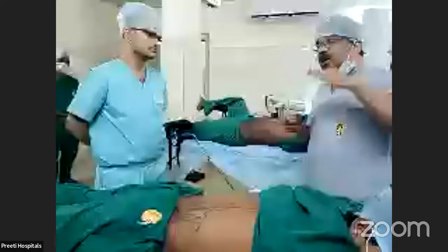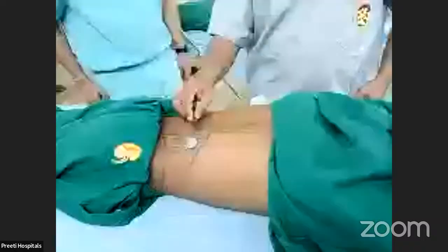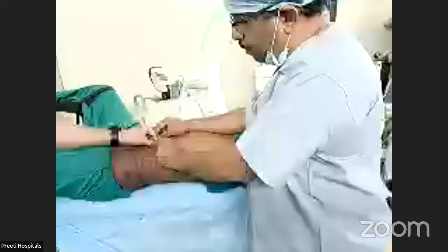So, benefit of doubt, which one do you prefer? Supine PCNL. Now coming to the pelvic stone, with an upper calycial stone as well. Same cluster level, same pelvic stone, and here an upper posterior calyceal stone like this. What will you prefer then?